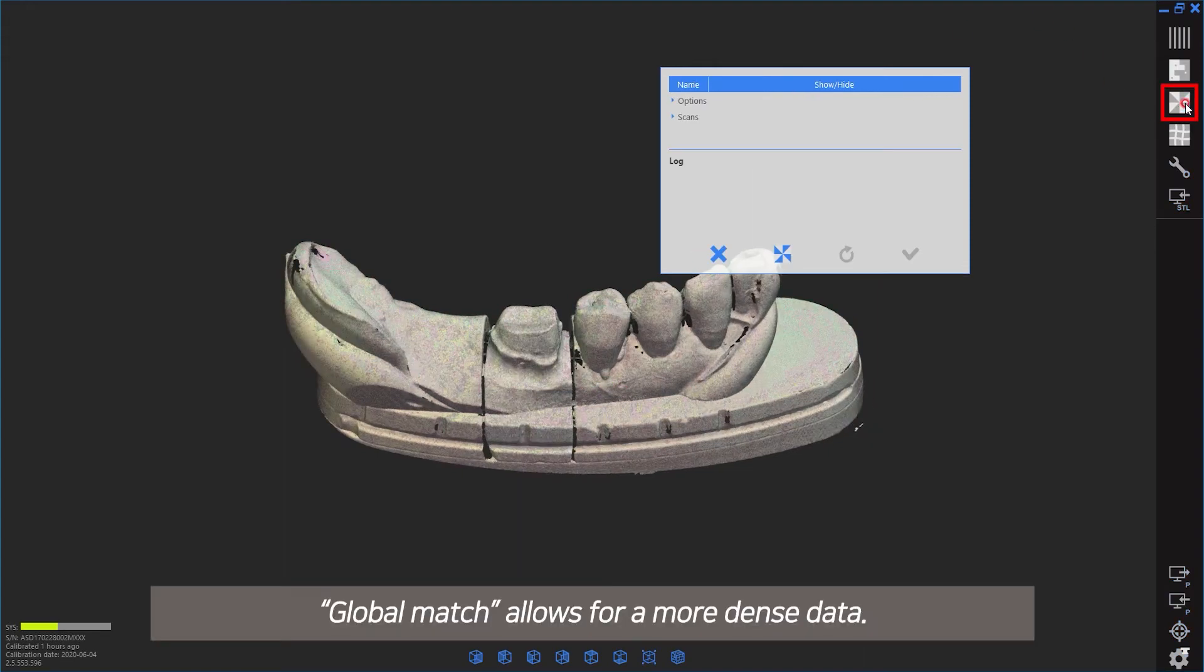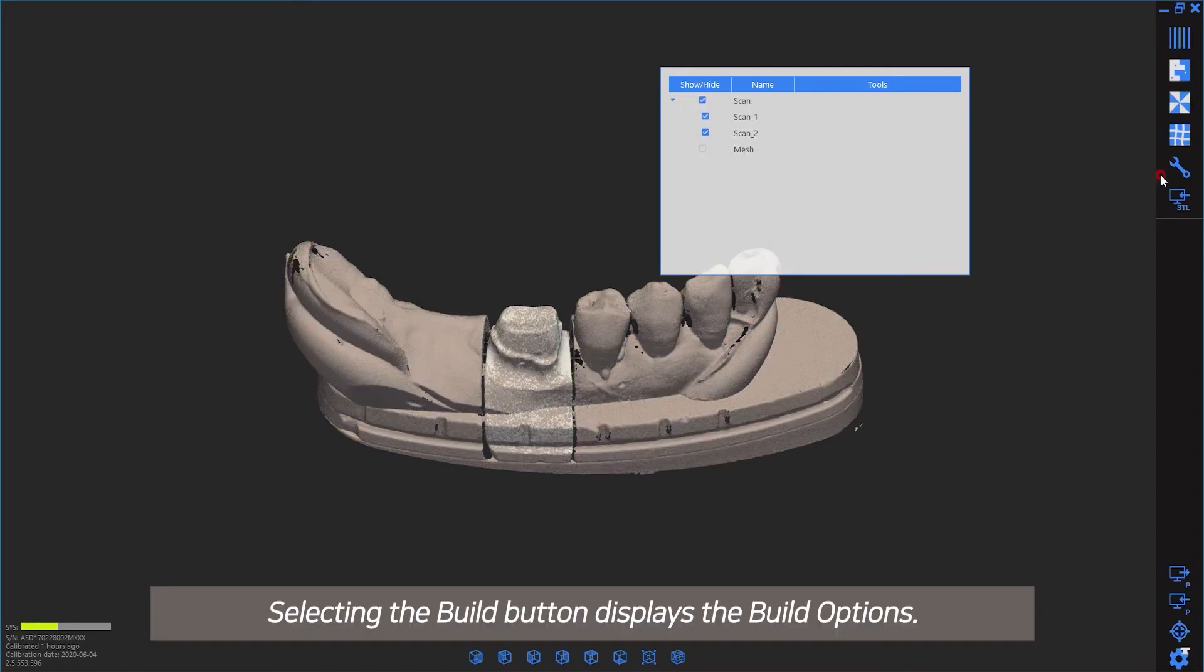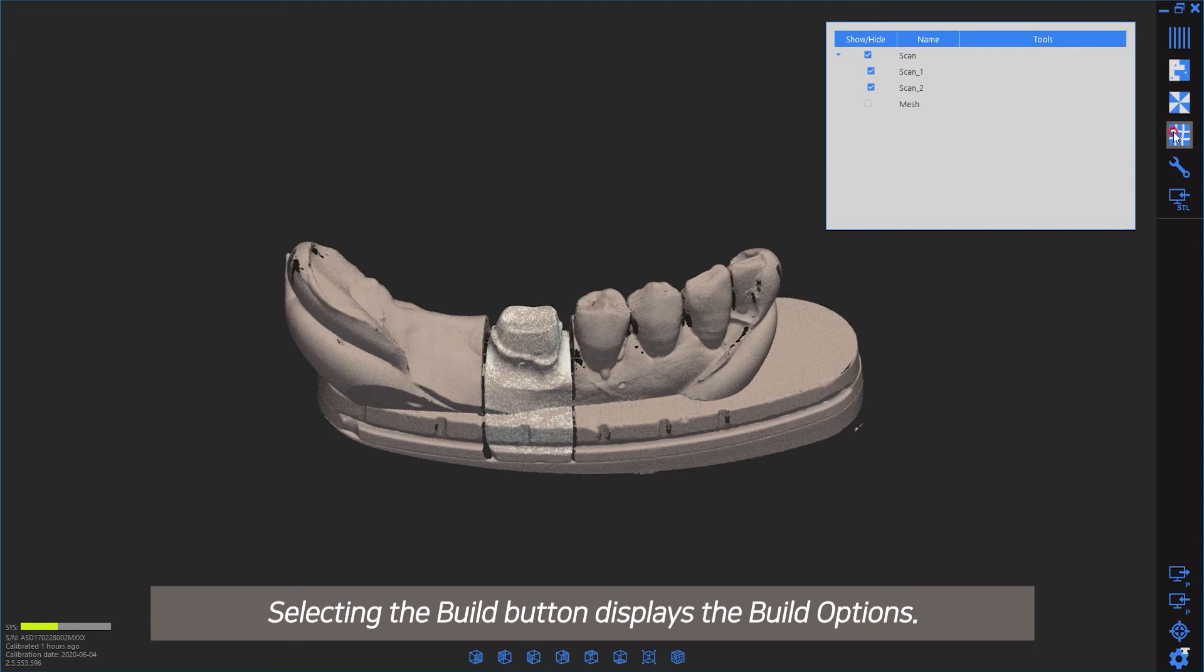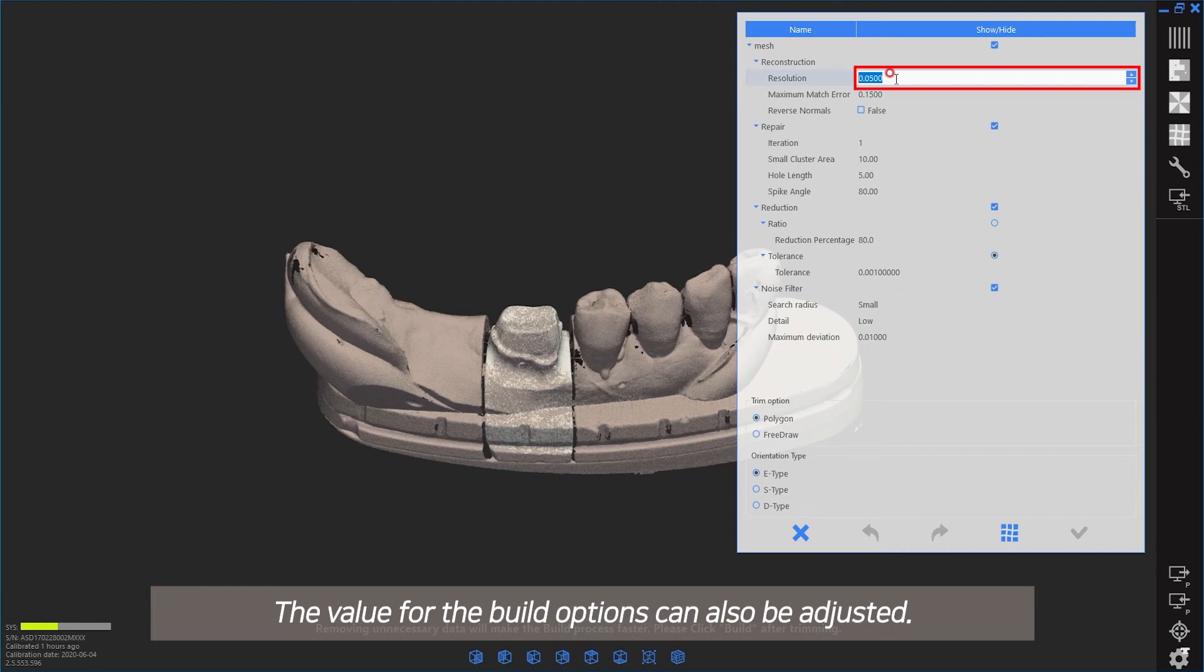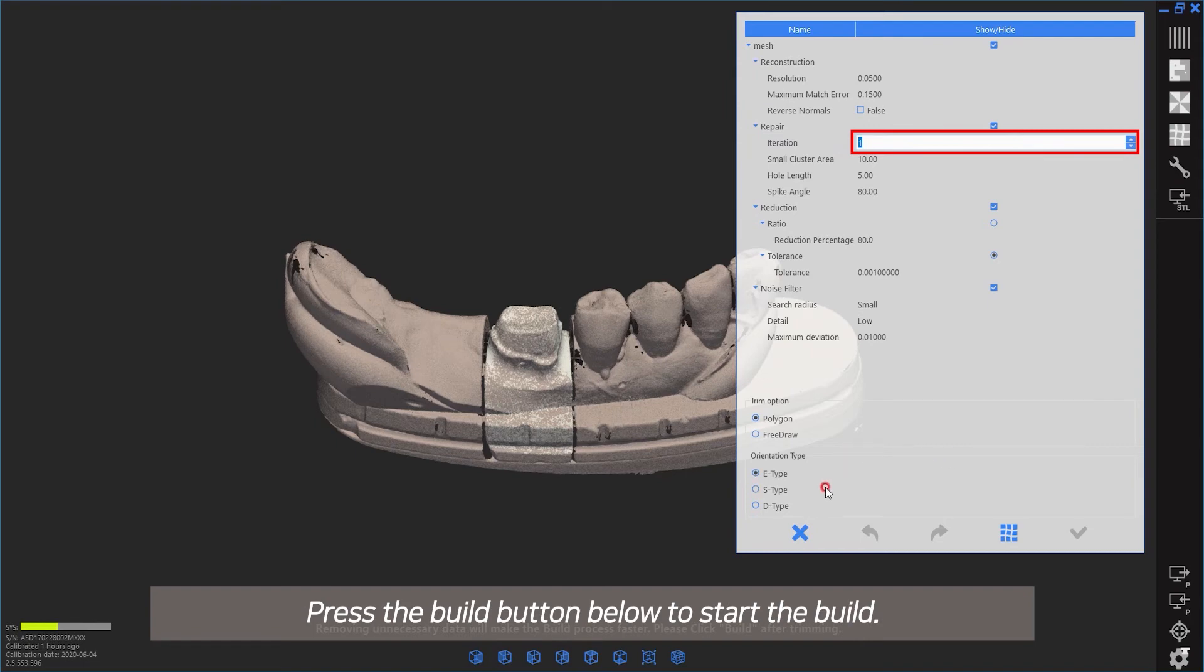Global match allows for more dense data. Selecting the build button displays the build options. The values for build options can also be adjusted. Press the build button below to start the build.